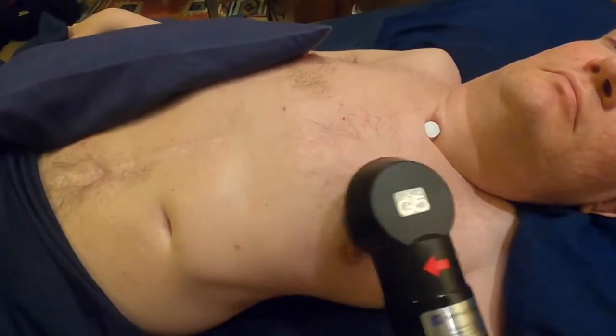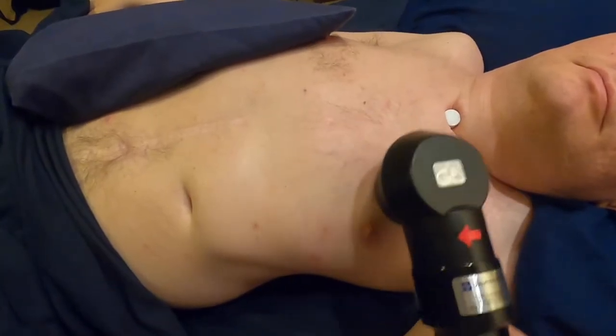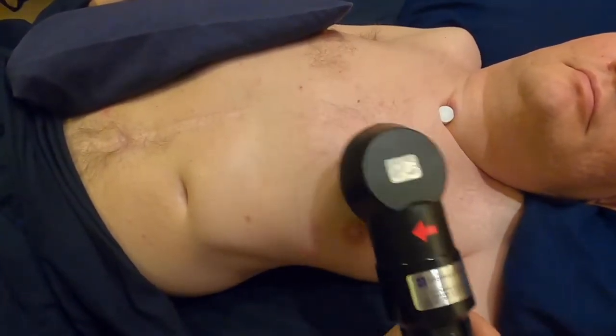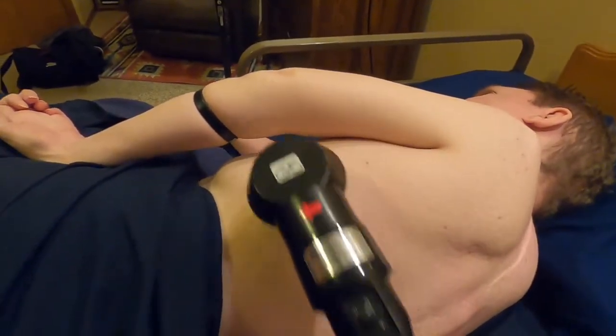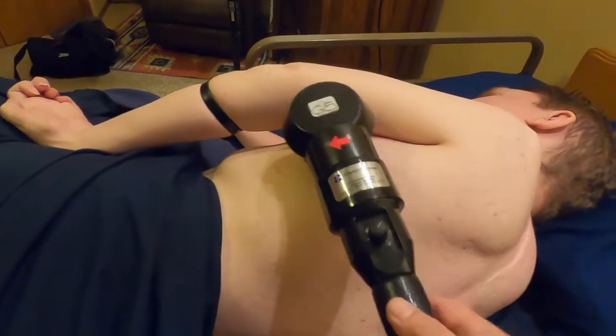So what I do is called a chest percussion treatment, or a CPT. It's basically just a vibrating wand that we move up and down my chest, and it helps to move stuff around in my lungs and keep junk up. And then we turn me on my side and also do it again on my back, so that way we get the front and back of my lungs. That combined with the turning helps quite a bit, and I usually don't have much trouble with lungs. However, getting the equipment is the problem now. I've done this treatment twice, every night for as long as I can remember.